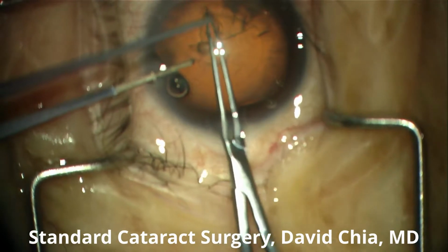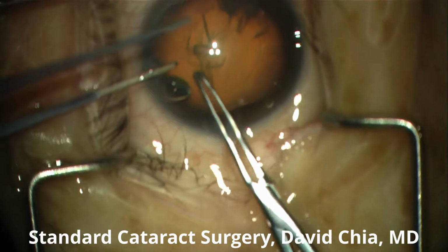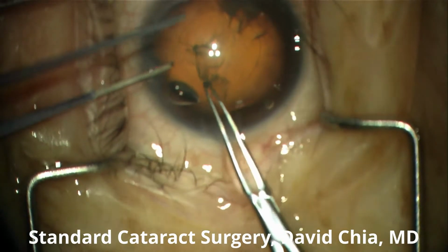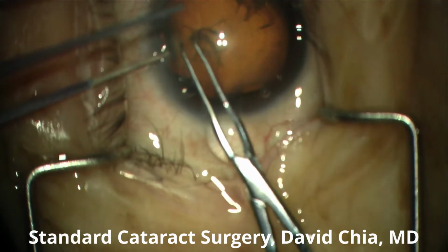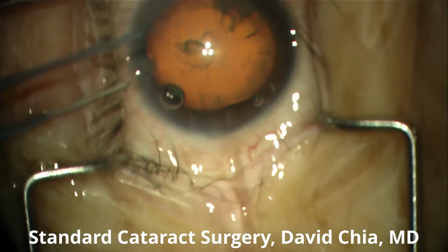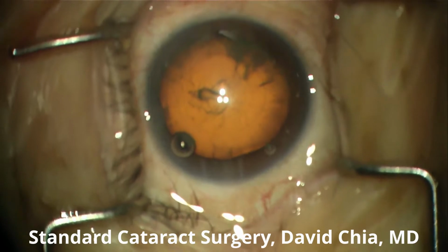The successful creation of the capsulorhexis is one of the cornerstones of modern cataract surgery. This can be done in a variety of fashions, but this is completed in this video with a manual forceps. And you'll be able to note the circularity and centration at the end of the procedure.